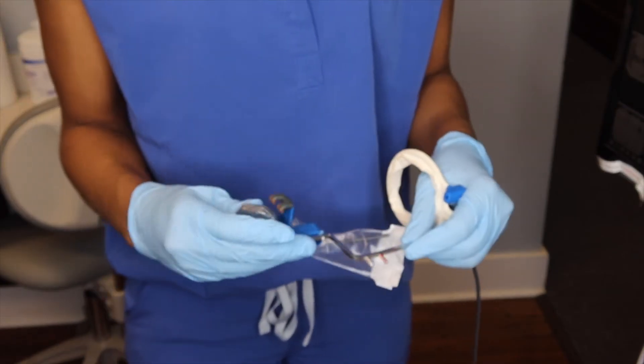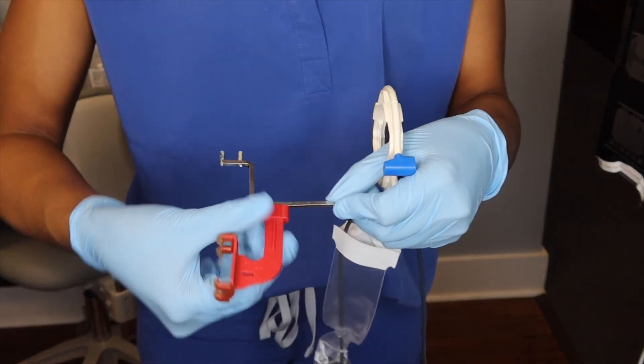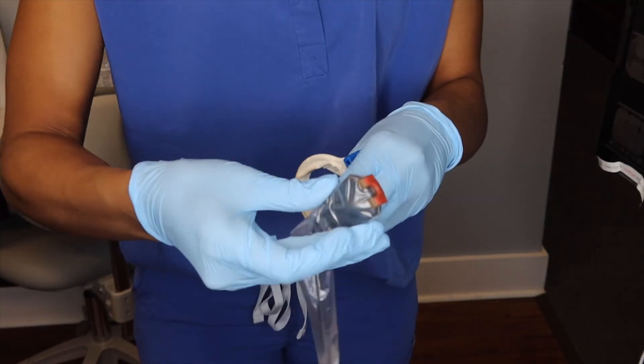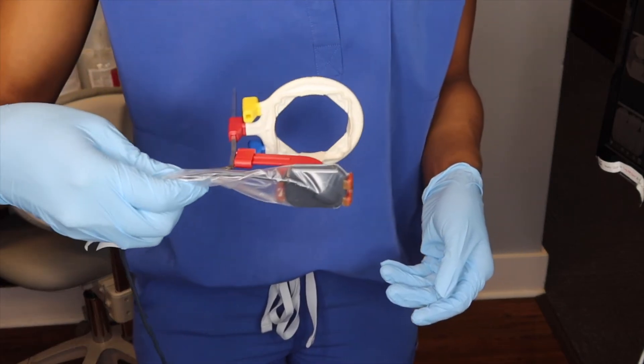Immediately after finishing the top teeth, you drop down and do the bottom teeth from left to right — then you're done with the anteriors. The only thing left is bite wings. Bite wings call for the red bite tab, so you do need to reconfigure the ring device. While doing that, let the patient know there are only four left — two on each side — and that they're level bites, so they're a lot more comfortable. This lets the patient know they're almost done and gives them encouragement to keep going.